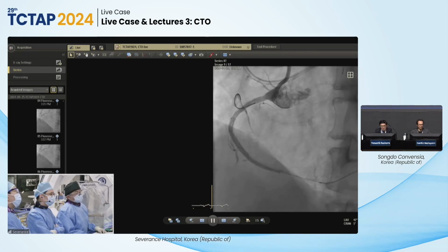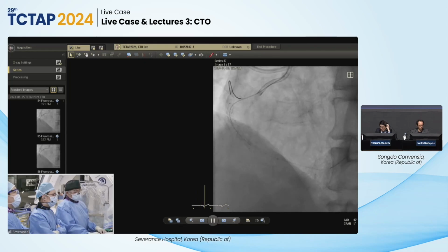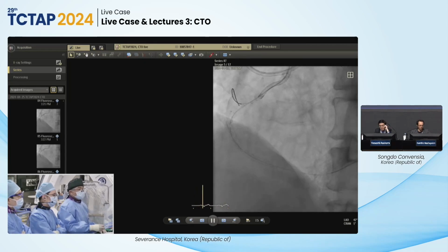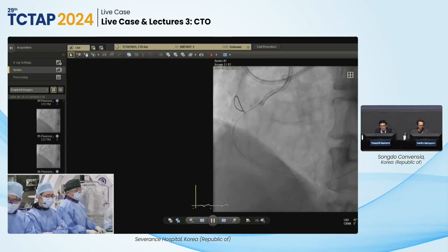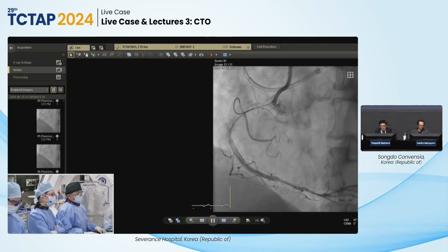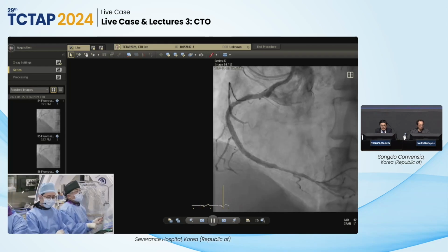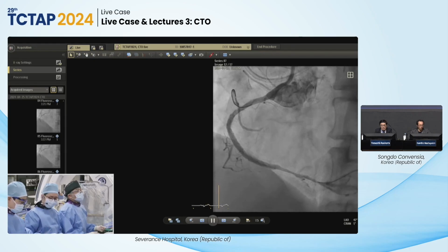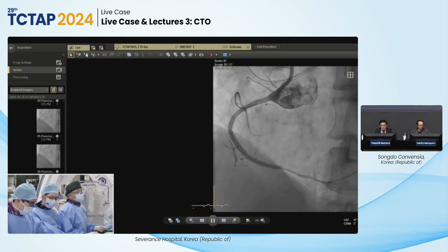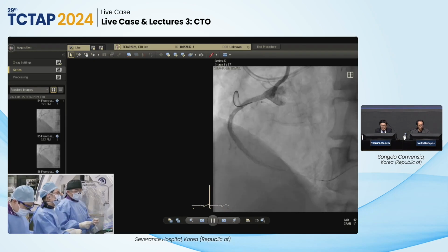Yeah, as well. Probably here I would put another 3.5 stent, I don't know, proximal maybe 16 or 20 millimeters. And distally, I don't think that this is a real disease. It seems to be spastic, or maybe what I do in my practice is that I go down with a balloon and just do 2 or 4 atmospheres. But if you have the IVUS there, and there is no disease, you might do nothing, right?